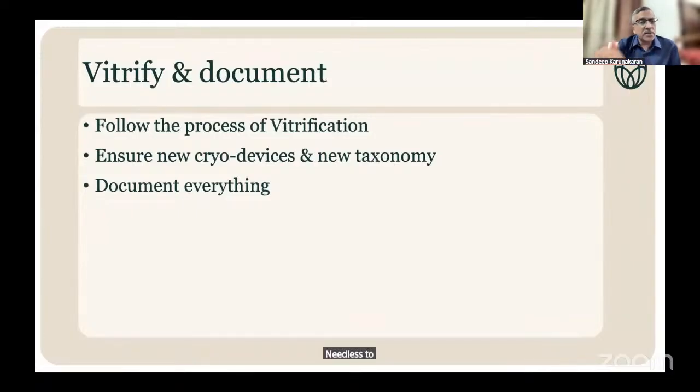Needless to say, after that, you follow the process of vitrification. Ensure new cryo devices are used and store the device in the correct place. That's called taxonomy. And obviously, document everything.